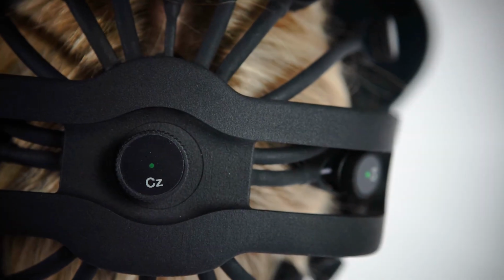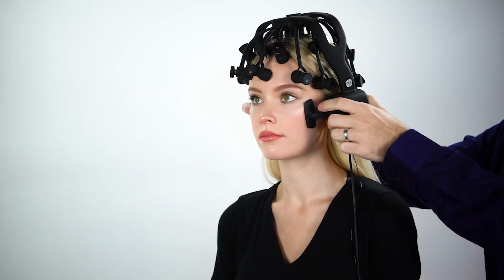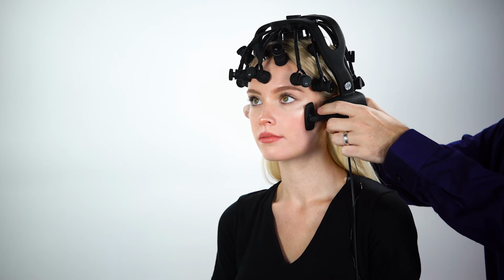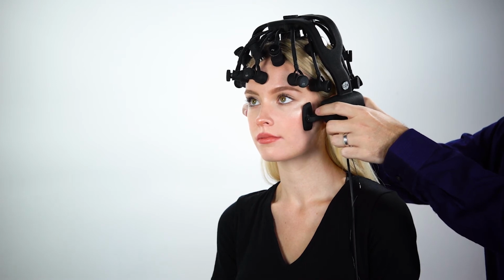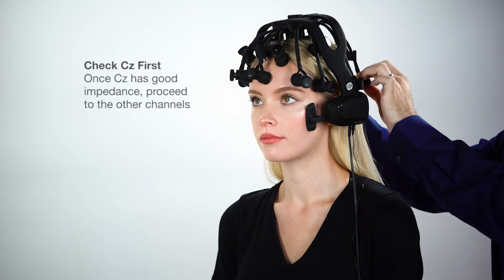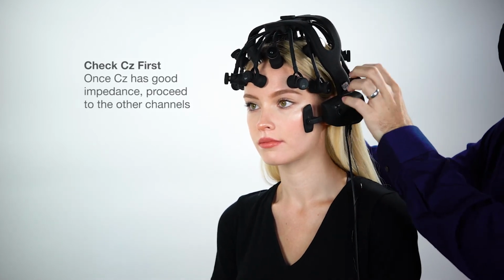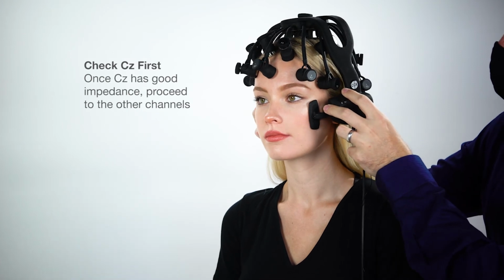Check CZ first, and make sure the impedance light is green. If not, gently pull down on the handles until the CZ position makes adequate contact with the top of the head. Always perform this step first. It's important to get good impedance readings on CZ before moving on to the other positions.